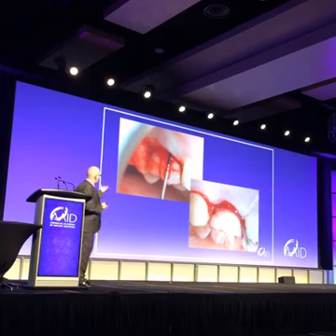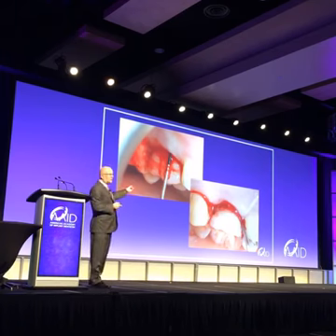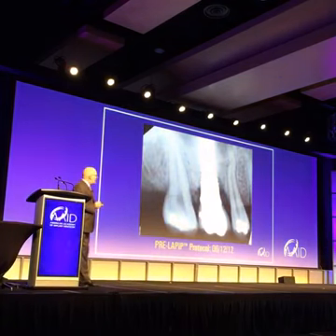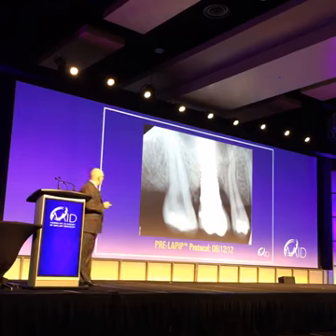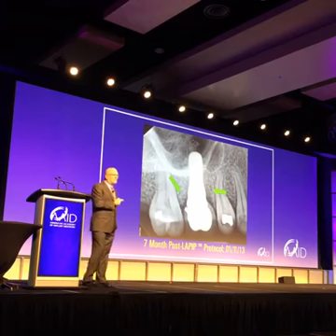This is what she looked like before. You can see the depth. Look, we're probing it on the mesial palatal. That's over 12 millimeters deep. That's pretty bad. Here's the bone loss around the implant on the PA. Here it is 7 months later. There's bone growth there. Things are filling in.